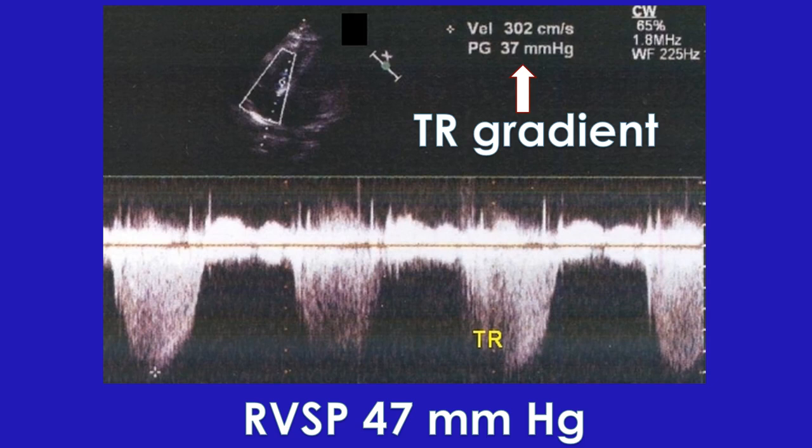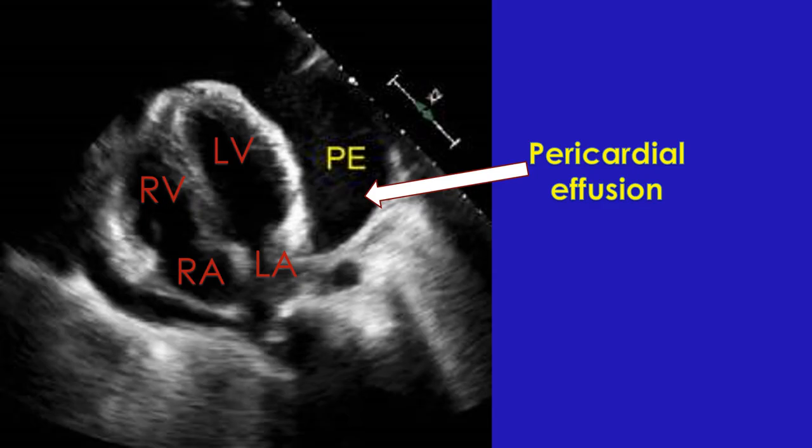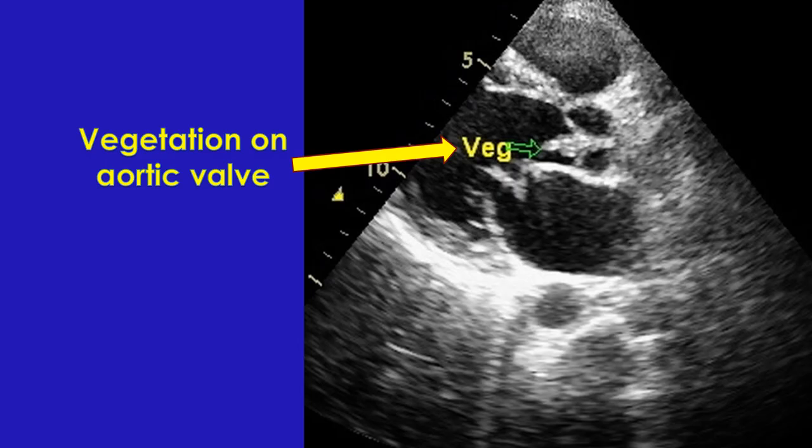If there is fluid collection in the pericardial cavity, it is reported as pericardial effusion. The estimated amount of the collection will be reported as mild, moderate, or large. Diastolic collapse of the right atrium and right ventricle may be noted in cardiac tamponade. Gross thickening and calcification of the pericardium may occur in chronic constrictive pericarditis.